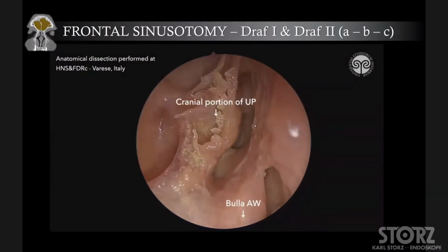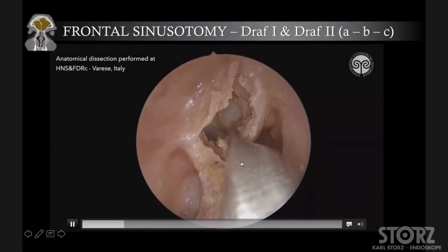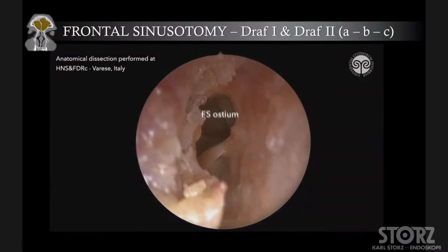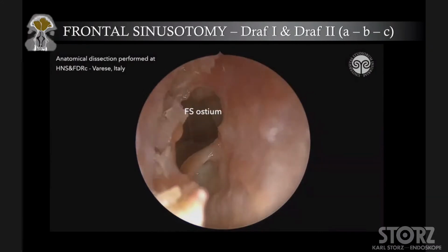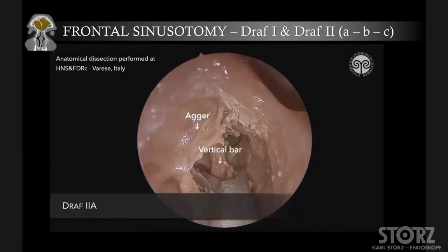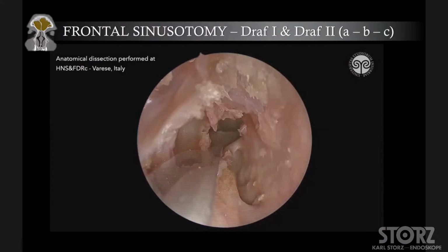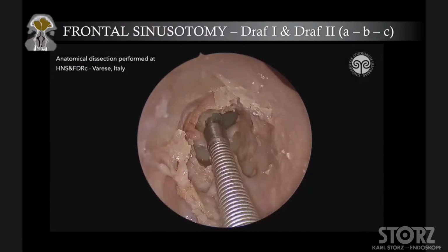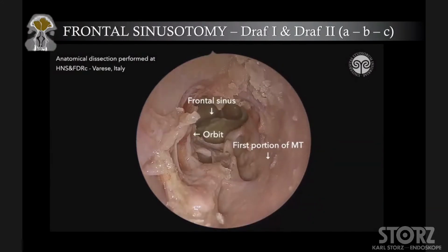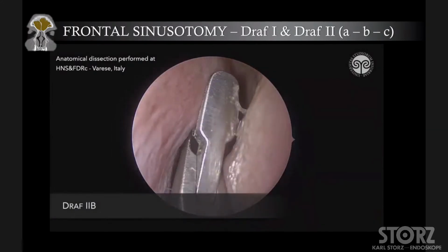Bulla ethmoidalis, cranial portion of the uncinate process, you can see. So you have to disassemble the cranial portion of the uncinate process. You have to cut the cranial portion of the uncinate process in this way. And once the cranial portion of the uncinate process has been cut, you can reach the frontal sinus. This is the vertical bar. We are cutting the vertical bar, that is the cranial portion of the uncinate process. You can see the frontal sinus, orbit, and the first portion of the middle turbinate.